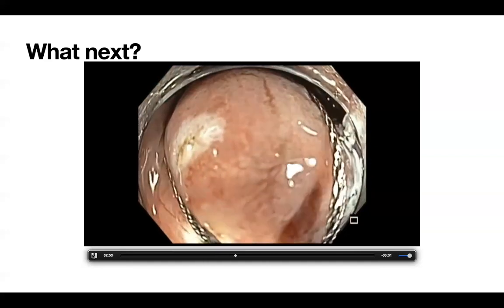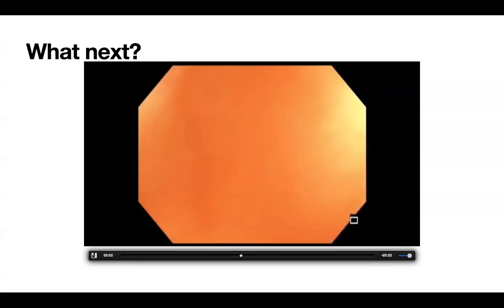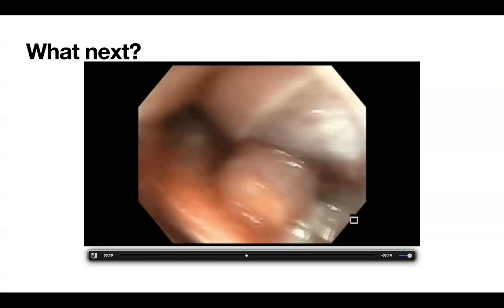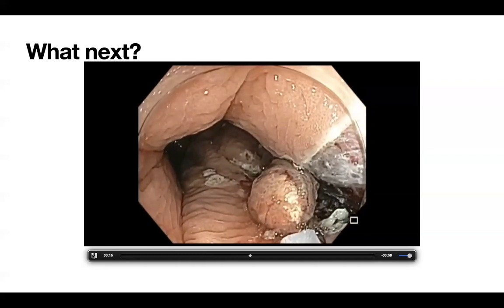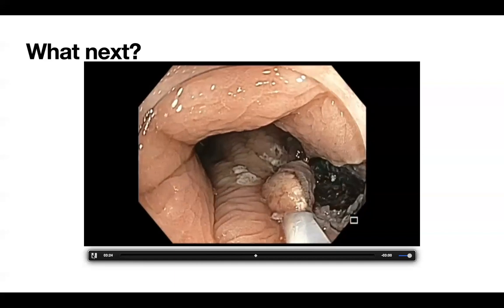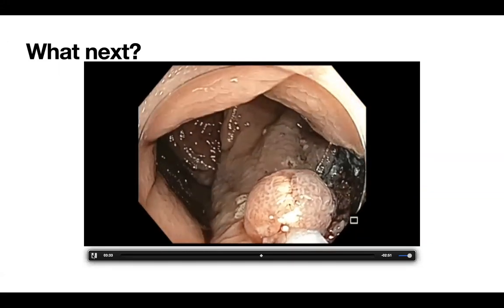As I'm doing the case, I'm also worried that I don't entrap a big vein, because entrapping a big vein would automatically lead to a bigger bleed. So as you can see here, I did not know whether I got a vein underneath or not. So in this case, what I've done is I've basically distended the colon or the rectum here, and then loosened the snare to see if there's any tissue underneath that would fall back. And then again, you can see that I can loosen the snare and then cut, hoping that this will cut down my risk of having a major bleed.